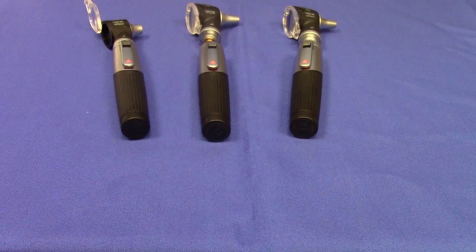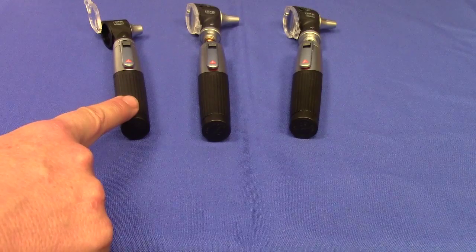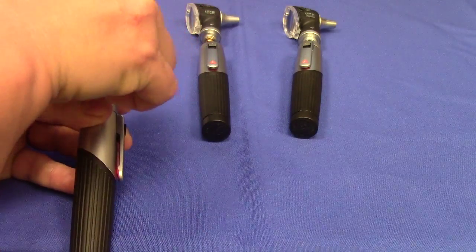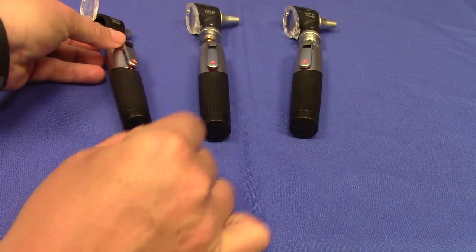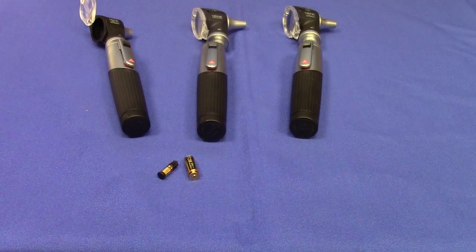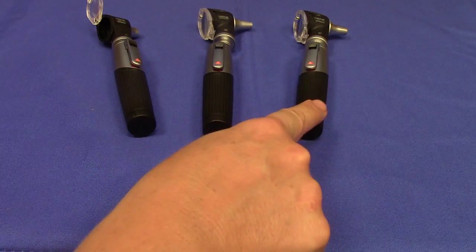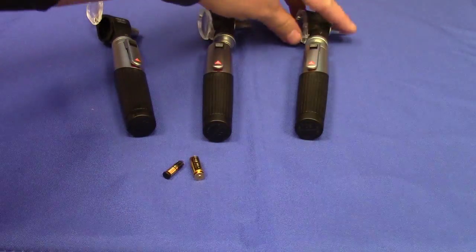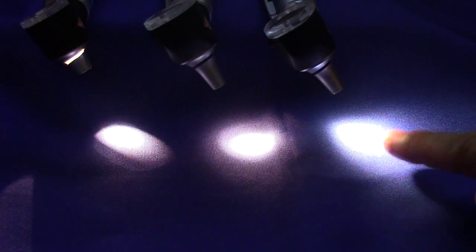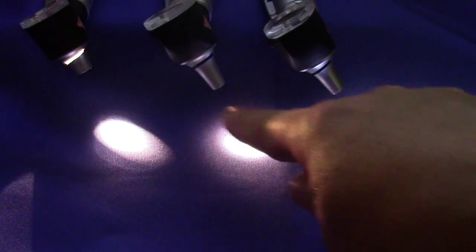Each of the three Heine Mini 3000 pocket otoscopes use different bulbs. Both the non-fiber optic Mini 3000 and the fiber optic Mini 3000 use a standard xenon halogen bulb, although the shape and size of the respective bulbs will differ, so it's going to be very important to make sure that you order the correct replacement bulb based on whether you own a non-fiber optic or a fiber optic Mini 3000. The LED version uses a completely different bulb — it is equipped with a high performance LED bulb, located on the far right, which shines the brightest and provides the most homogeneous illumination, thereby optimizing visualization of the ear canal and tympanic membrane compared to the other xenon halogen bulbs.